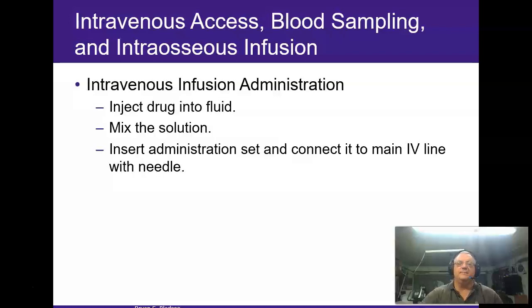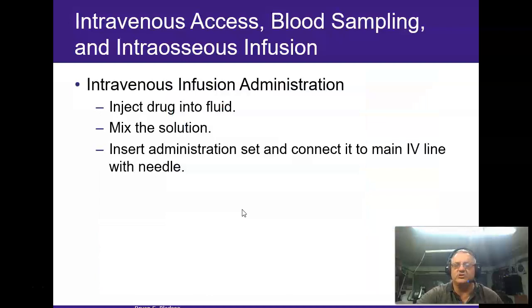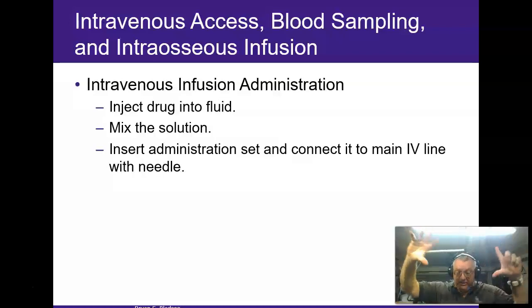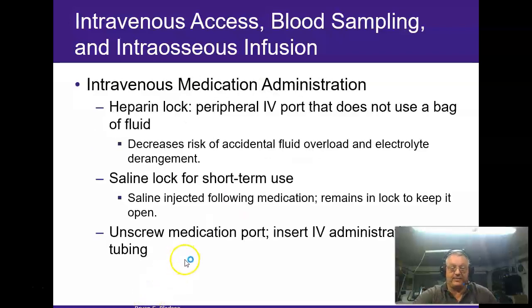Intravenous, again, mix the solution. And one other thing that I didn't see here, guys, make darn sure that you label that bag with what has been added. Make it really big where they know that it's been added. If it's a vial, I will usually tape the vial to the bag so that they know exactly what's in that bag, okay?